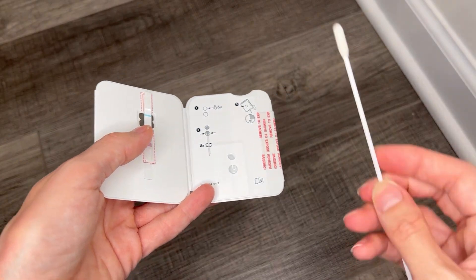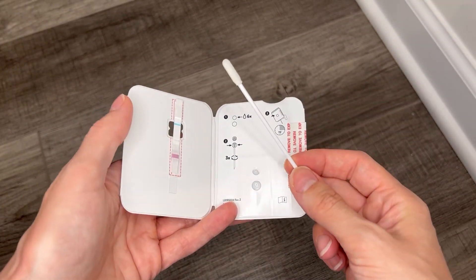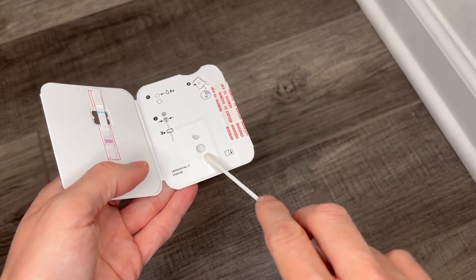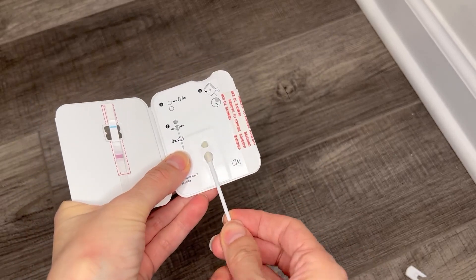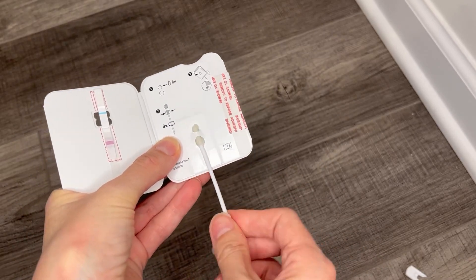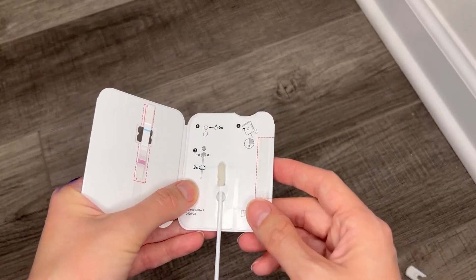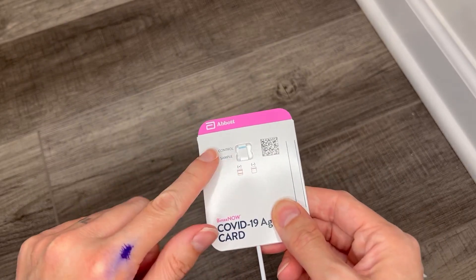Then you take your nasal swab and do the test as the directions say. And then after you're done with that, they want you to take the Q-tip and put it in here like so, and turn it around three different times. Then you take this off, you close it, and then you wait 15 minutes and your result will be right here.